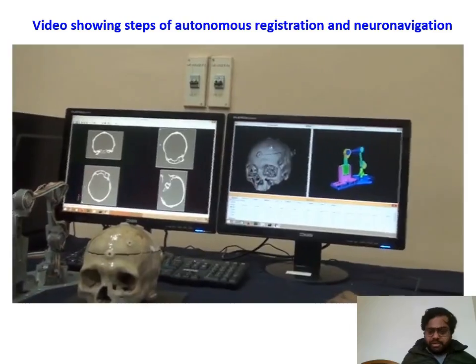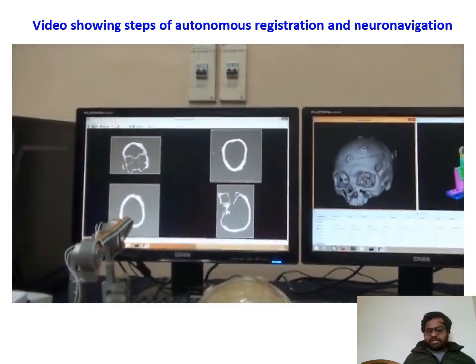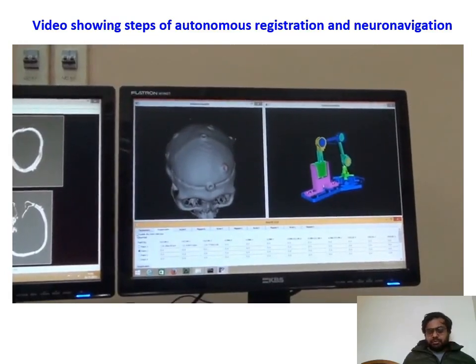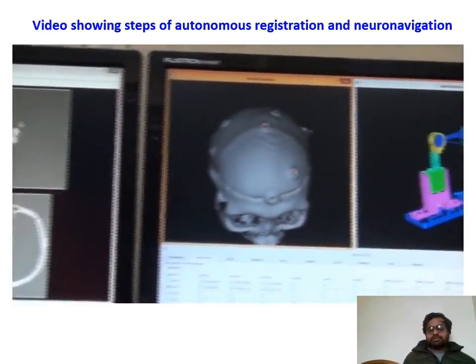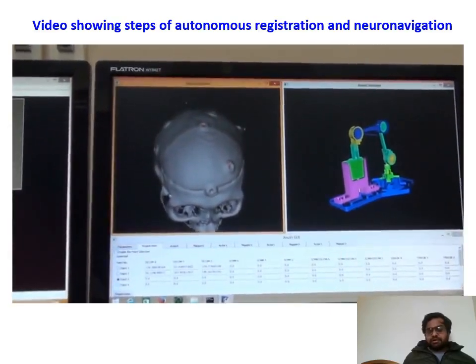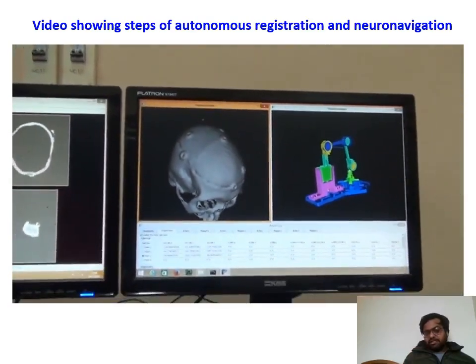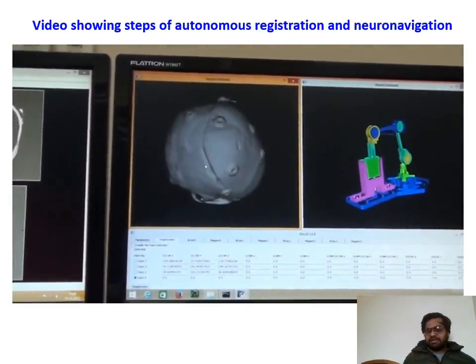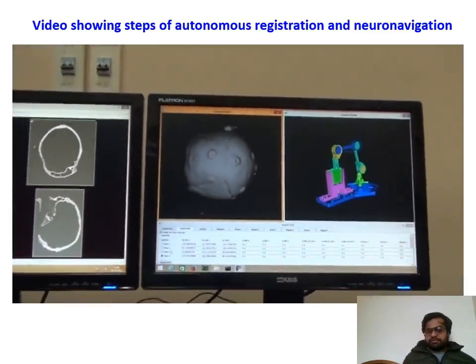The first step is measurement of fiducial markers in medical image space. As you can see on the left hand side, those are the cross-sectional images obtained from the CT and MRI: axial, coronal, sagittal, and oblique images as well. On the right side you can see the 3D model of the skull obtained by stacking those two-dimensional images. This 3D skull is very useful for measurement of markers. As you can see, the radio opaque markers are visible in the images, and we are measuring the coordinates of the markers in medical image space. A minimum of 3 markers are required, but it's better if we have more markers visible to measure.